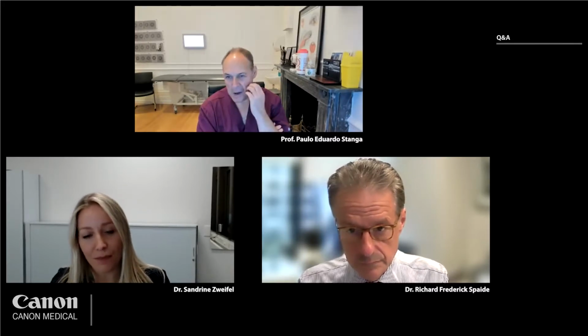Thank you. Sandrine, a question from Gabor. How does segmentation perform in the periphery? How reliable are the readings, and is it difficult for the subjects to comply? Gabor, thank you very much for this question. For people who have not good visual acuity, it's not so easy to hold the fixation. And therefore, there are artifacts, especially in the peripheral part.